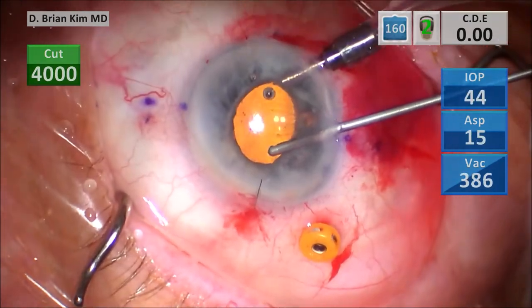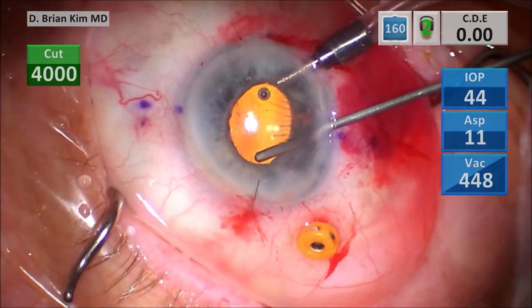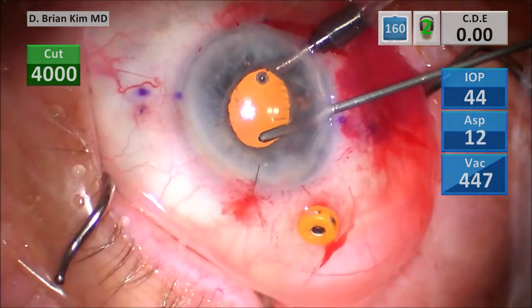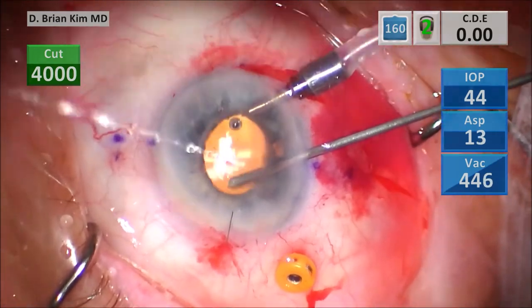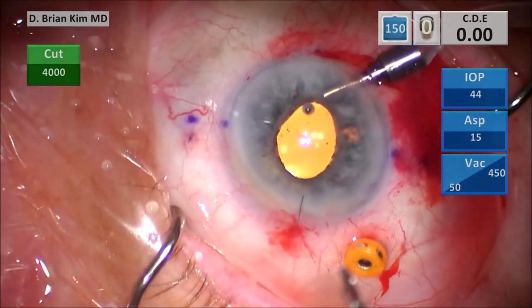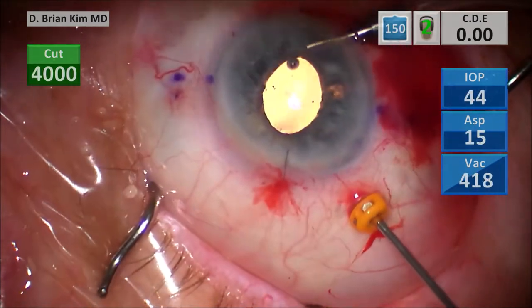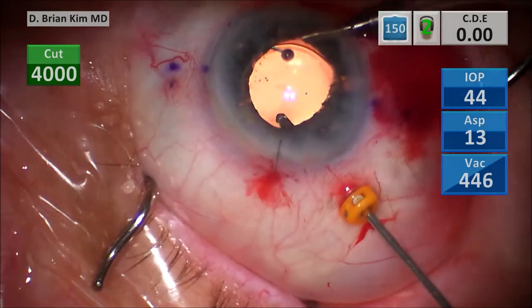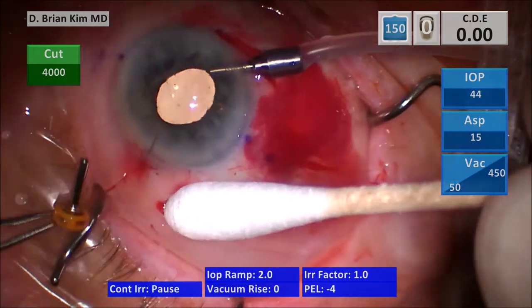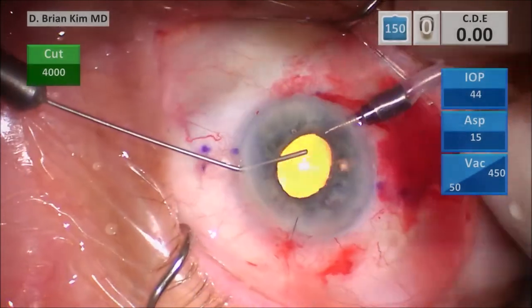I can see there's a little bit of vitreous right there at the wound, so I spend a lot more time doing vitrectomy, wanting to make sure there's no vitreous in the anterior chamber, going posteriorly as well and getting around the pupillary edge because that's where the vitreous is going to wrap around. I pull the trocar out and massage the sclerotomy, then pull the AC maintainer out as well, and hydrate my incisions.